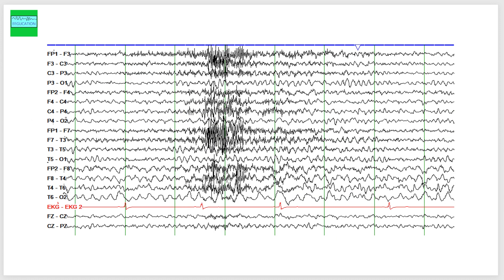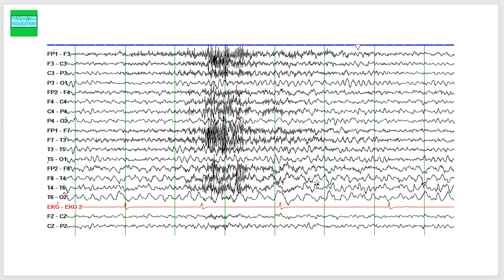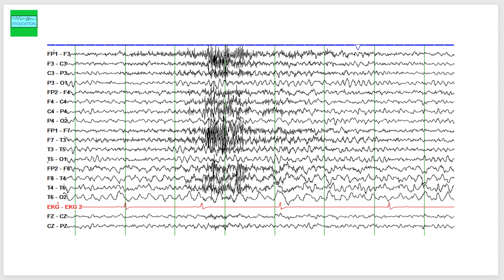Going back to the previous page here, you are starting to see an asymmetry. If you compare the left temporal region with the right temporal region, you see this polymorphic theta and delta activity in the right hemisphere. But at the same time, it's important to notice that as we start seeing this asymmetry between the two hemispheres, the ECG starts to get slow. So you are starting to see a bradycardia. Look at the interval between the QRS complexes and see how it is increasing.